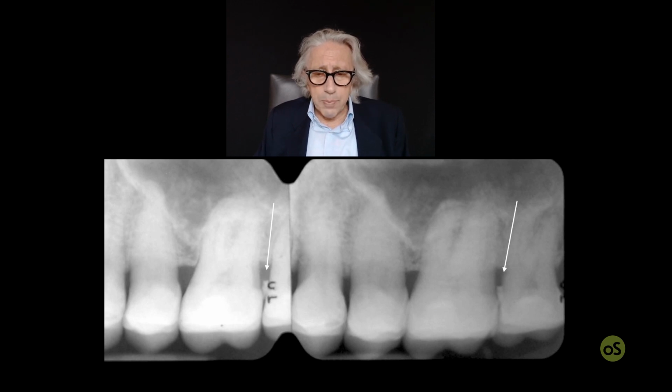We try to do our full mouth X-rays not on the same day of the cementation. We try to do that after 1 or 2 weeks if we can, if the patient doesn't come from very far away. Anyway, we don't do it the same day because it's easy to leave some pieces of cement excess inside. Normally you are able to see 2 weeks later that you have a piece like that, so you do the X-rays and then you can remove it with the help of the X-rays. Without them, it will sometimes be very complicated to see.